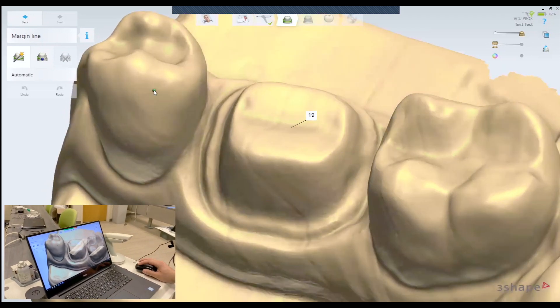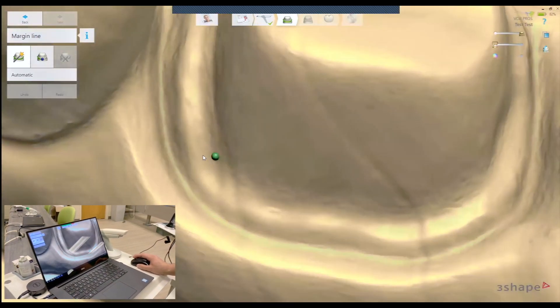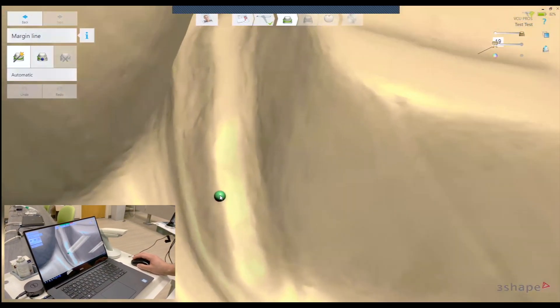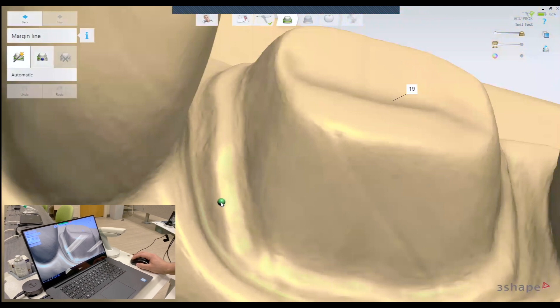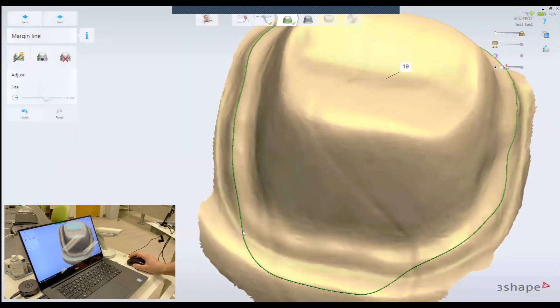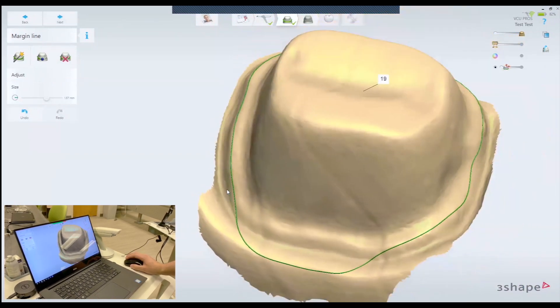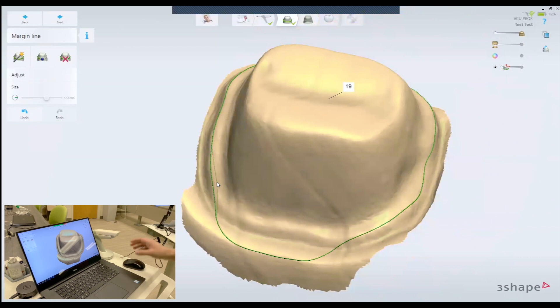At this stage, it's asking us to mark the margin line. So we're going to click on the sharpest area on your margin line like this, and it will usually auto-detect it.